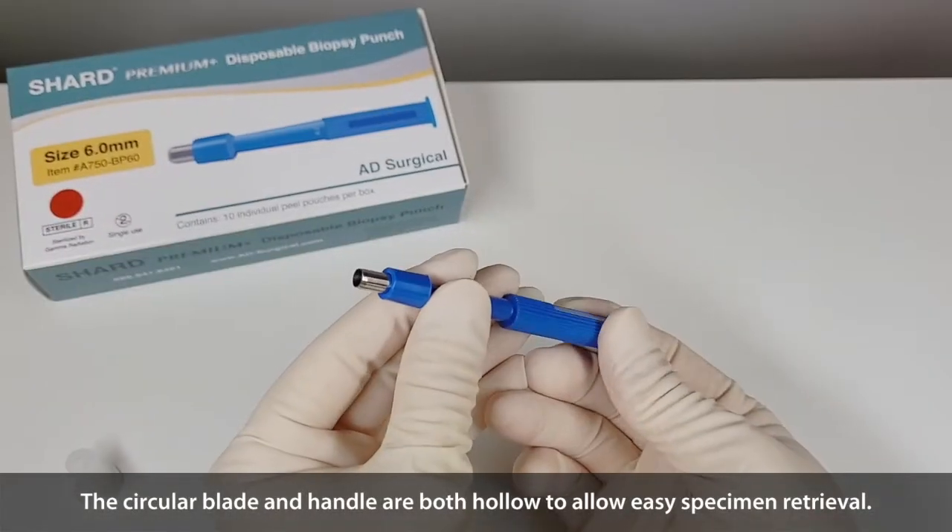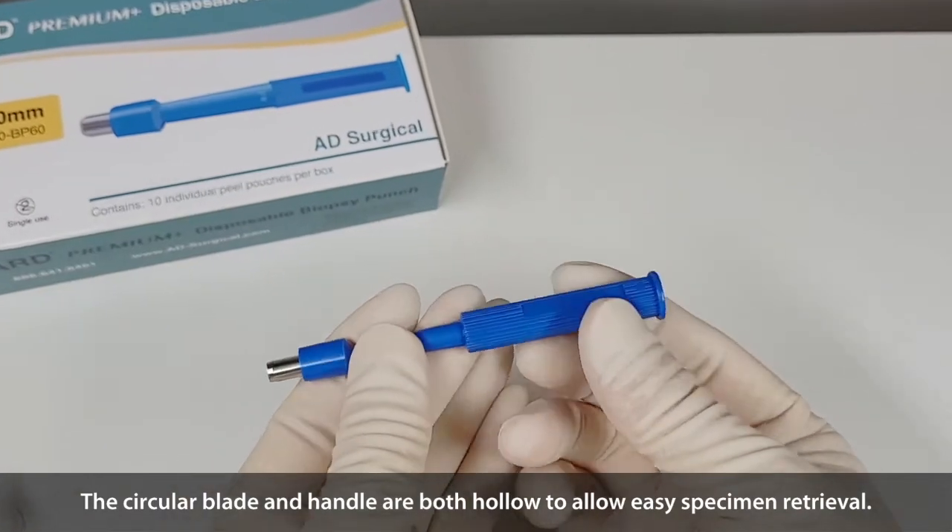The circular blade and handle are both hollow, to allow easy specimen retrieval.